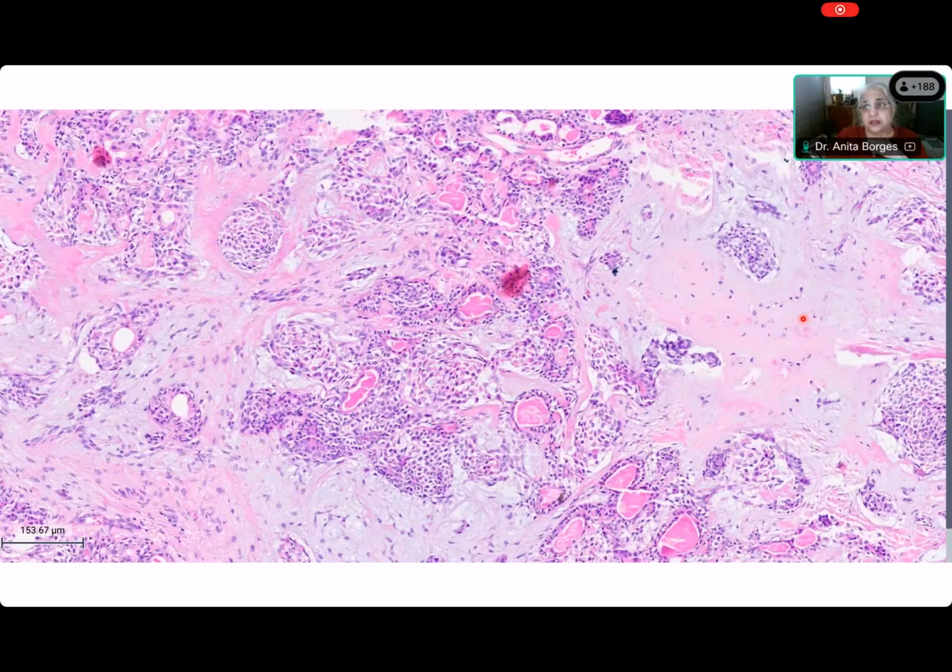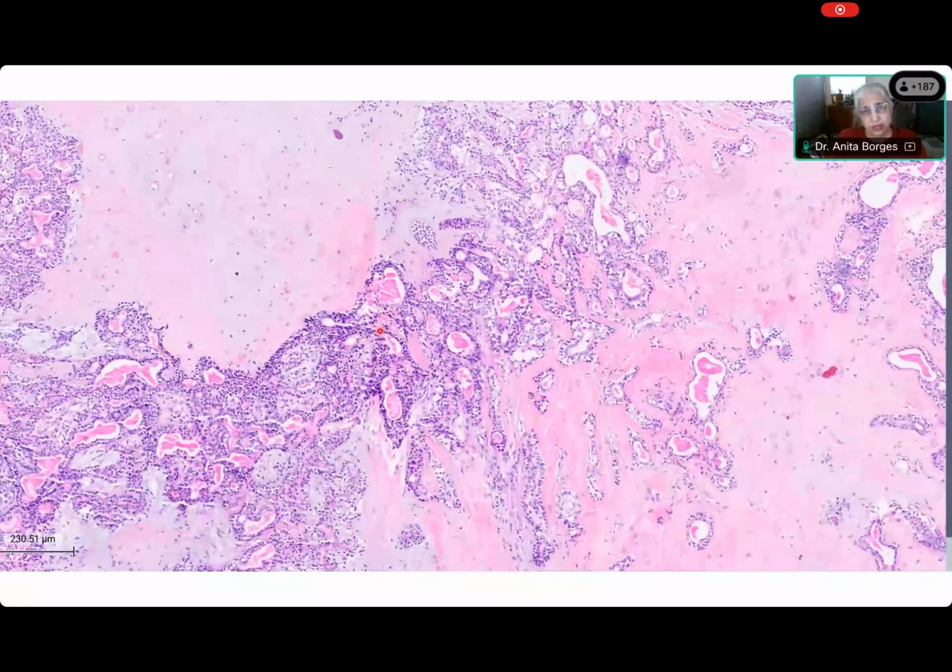Who said that? Sorry, Somik. Yes, ma'am. See, it's not just the abluminal cells, but there are cells that you cannot draw a nice clean line about. You see all these tiny cells, and they're all diffusing out into the stroma. That's a very important characteristic of myoepithelial cells. Now here, abluminal differentiation, and you see how these cells are diffusing out, particularly into the mixochondroid stroma.